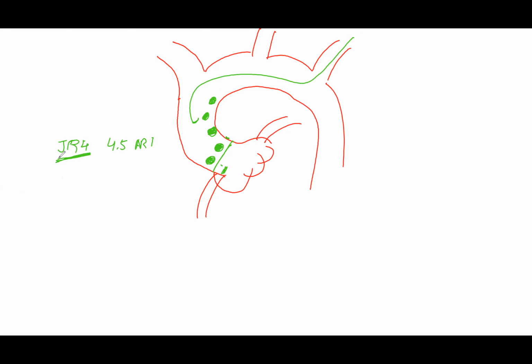The next catheter I usually use, if I don't get it, is I get the left main with the usual JL4 if I'm coming from the right radial, or JL3.5. You can use Tiger catheter, or some people use Judkins catheter. Once you get the left main, then you can use the same catheter to look up these again. Okay. For the RCA graft, if it's coming inferior like this, other options would be MPA catheter.